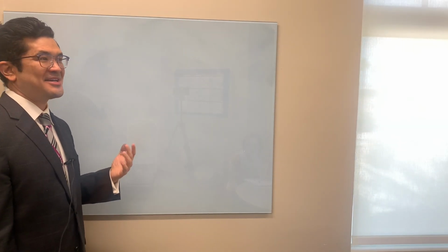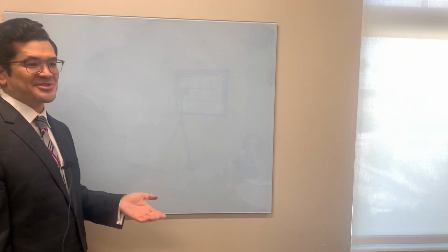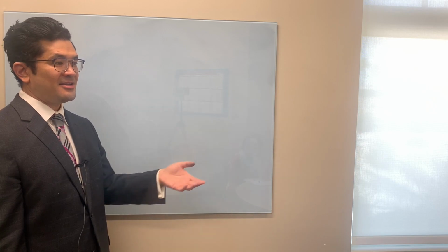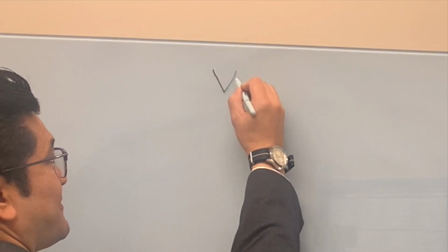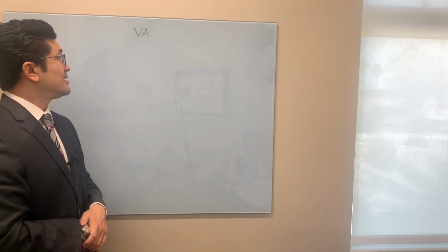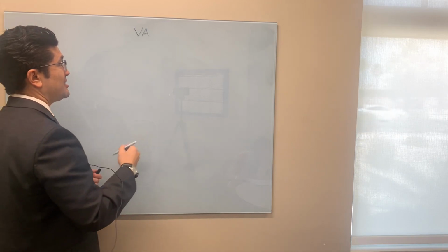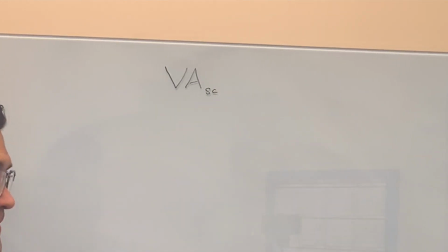Okay. The next section is people ask, how do I qualify for cataract surgery? So as a tech, you're going to get some of your workup for that, and the main thing is vision. So we're looking at our visual acuity. On the visual acuity, it's nice to get their uncorrected vision.